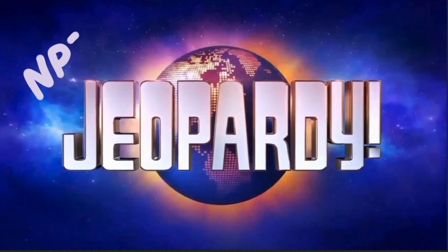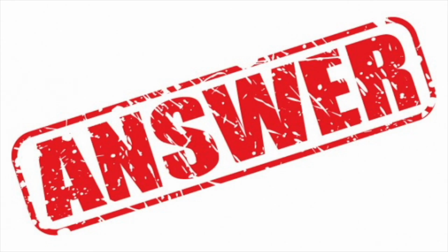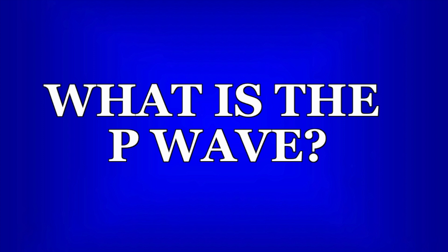Now it's time for NPT Jeopardy! Pause the video now if you want time to read and think about the question. Otherwise, you've got 5, 4, 3, 2, 1. The P wave is the first portion on the EKG strip, and it represents atrial depolarization, also known as systole or contraction. Hopefully that covers all of our bases.